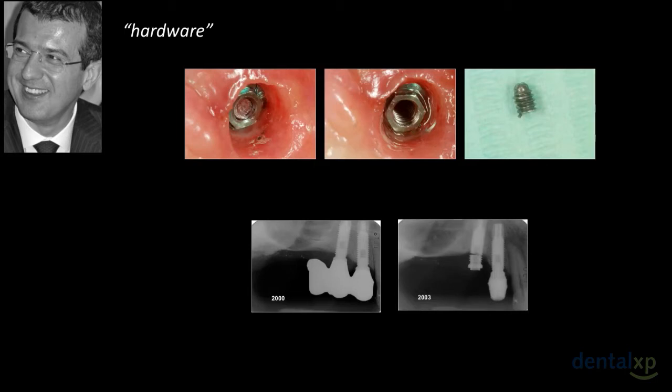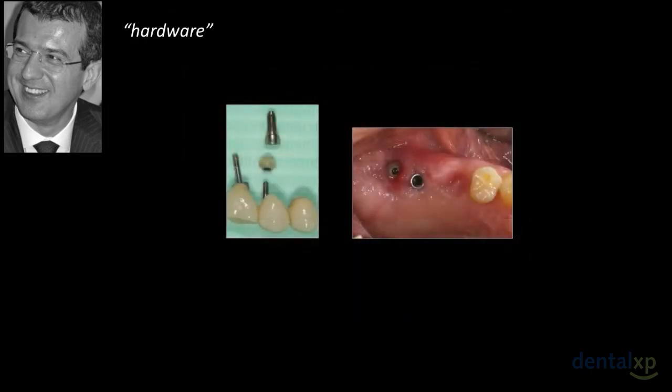But we do have problems with hardware also on conventional prosthesis, different problems, but yet we have this kind of problems. In the past there were attempts to emulate the way natural teeth are working, for example with these devices to soften the contact, and these attempts were made with a good intention, but they all ended up in failures.